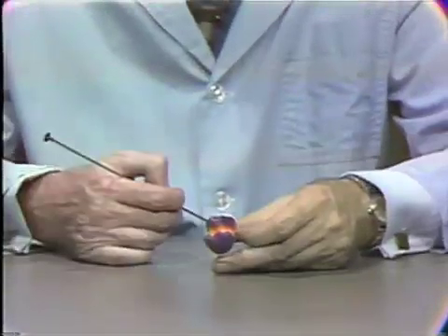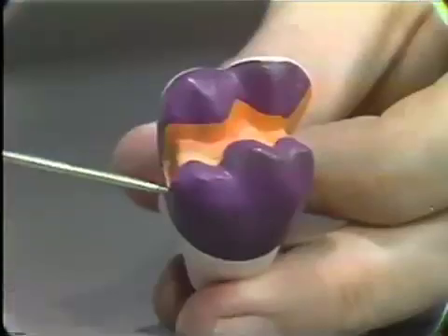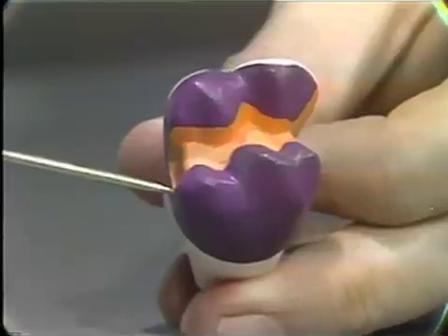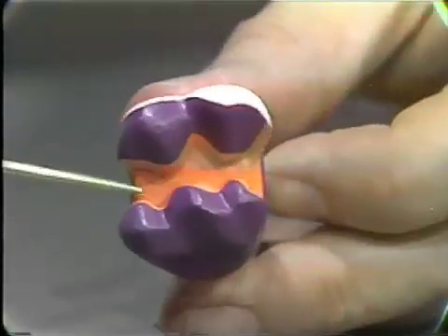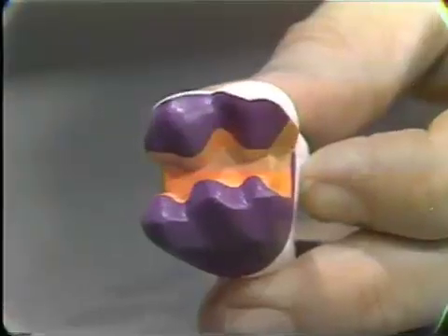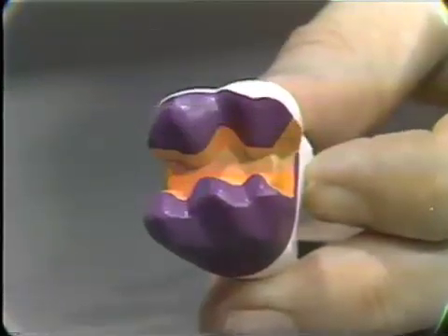This characteristic is projected onto the molar tooth and gives a preparation such as you see here. This is the box type of preparation on the molar tooth. And again, this has a slice on the distal surface and has the box type preparation on the mesial surface here, again, in order to reduce the amount of gold which is shown here.